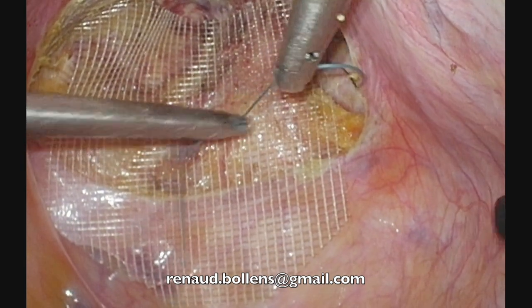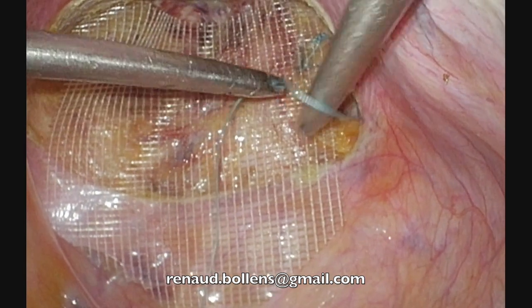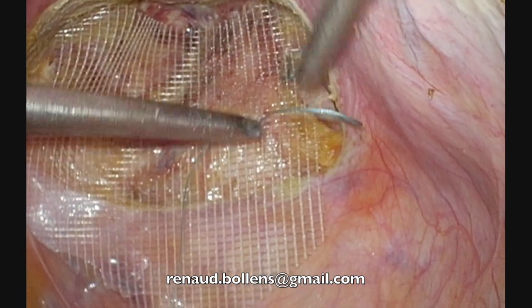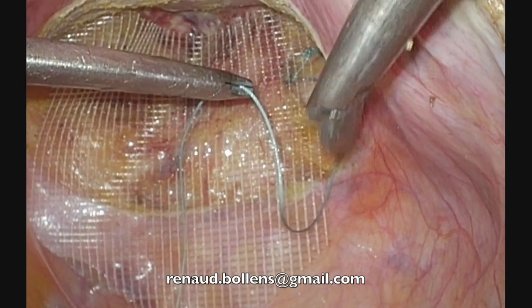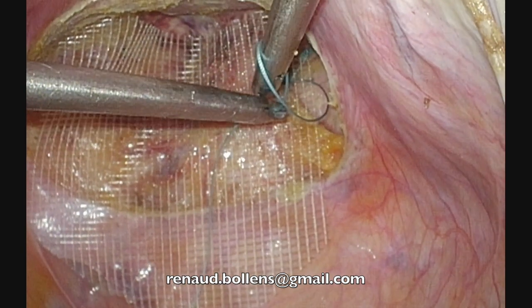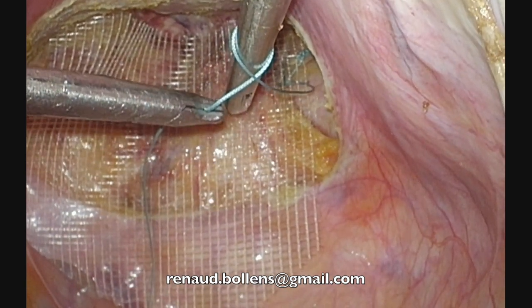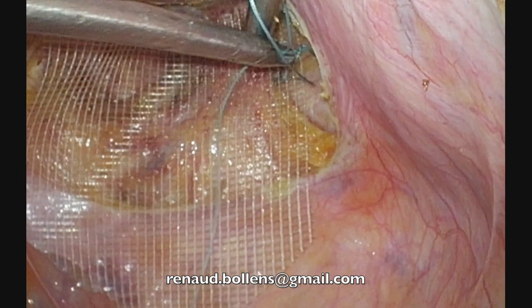Rotation, traction to place exactly in the same axis. I turn around and you see that with the suture going in the direction of my needle driver, it's very easy to turn around. If I place my suture in this manner, it's much more difficult to turn around. I have to place the suture in this axis. Turn around. I move my two hands together because this is a full loop, you see? If you have a full loop, it means that the suture turns completely around the needle driver.